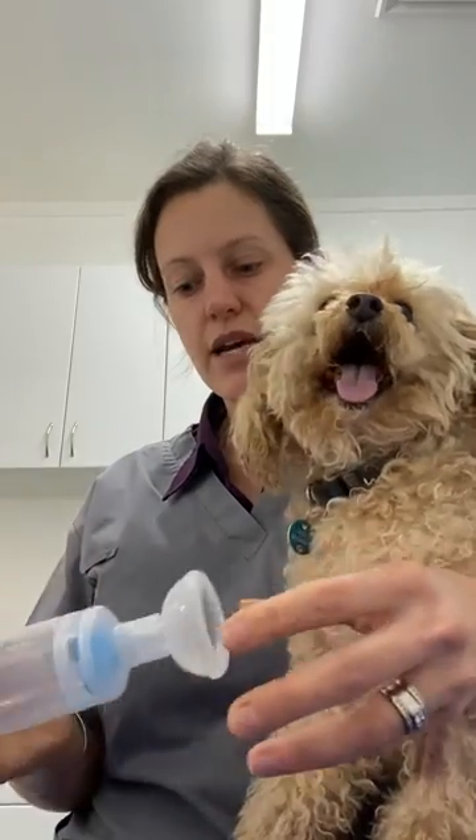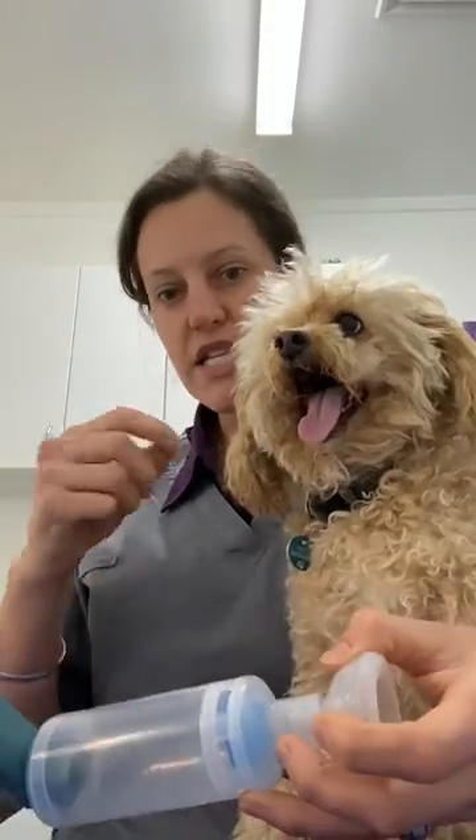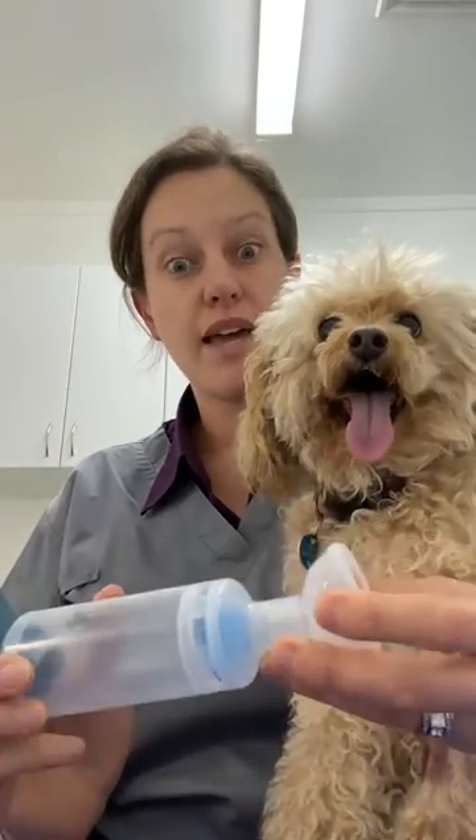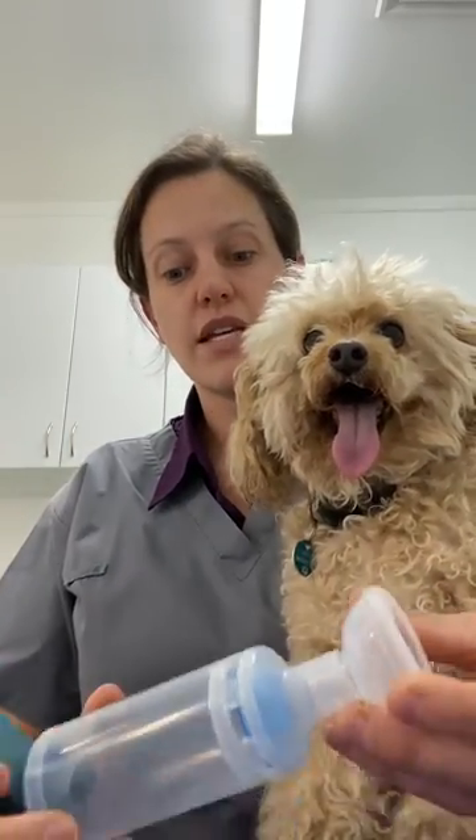So that's basically the setup — super easy. Treats afterwards, lots of rewards to keep it positive. As I said, most dogs and cats are really tolerant of this and it can make a difference.